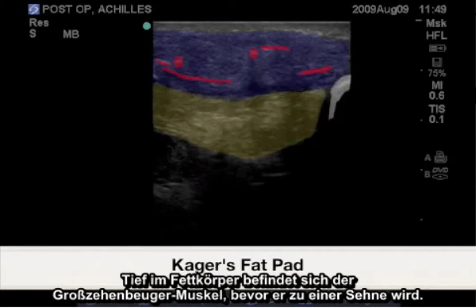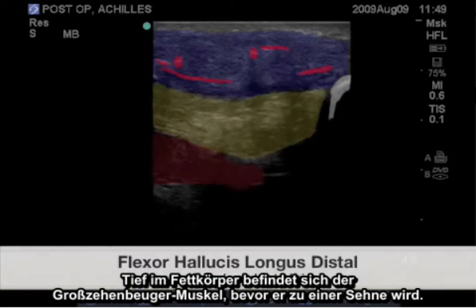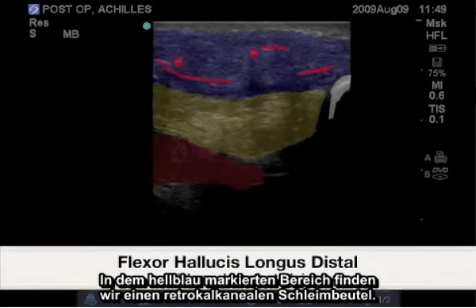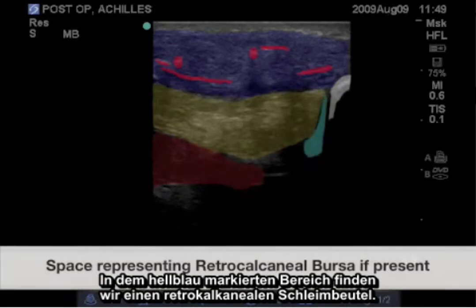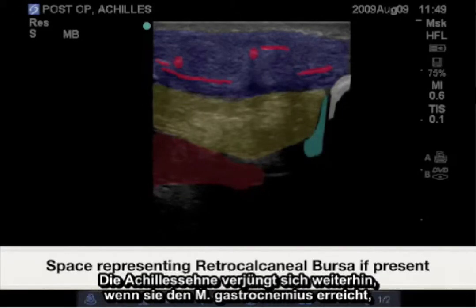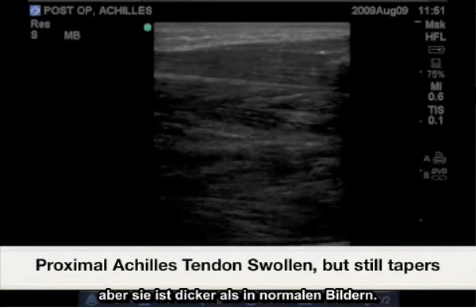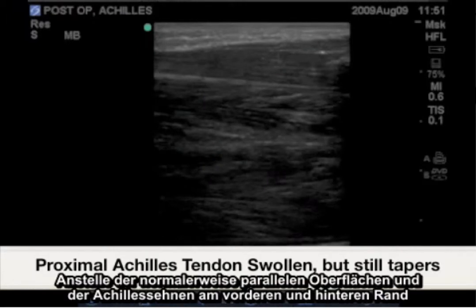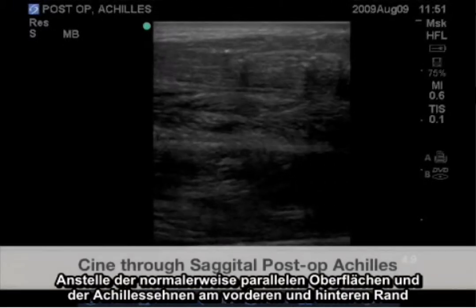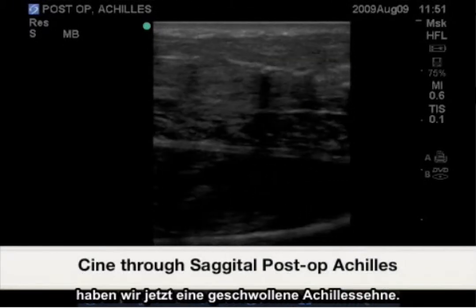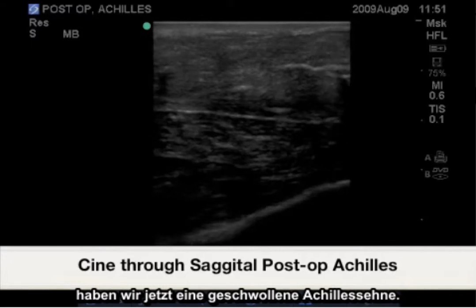Deep to the fat pad is the flexor hallucis longus muscle before it becomes tendon. The light blue highlighted area represents where we would find a retrocalcaneal bursa. The Achilles tendon still tapers as it reaches the gastrocnemius, only thicker than in the normal images. Instead of the normally parallel surfaces of the Achilles tendon's anterior and posterior margin, we now have a swollen Achilles tendon.